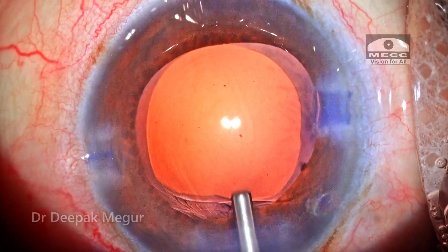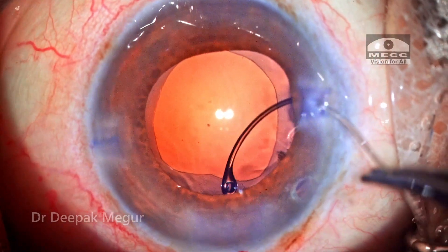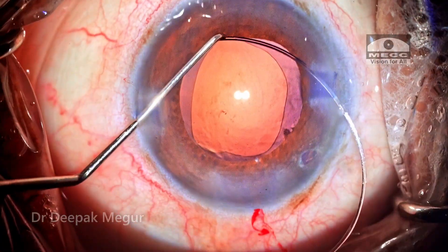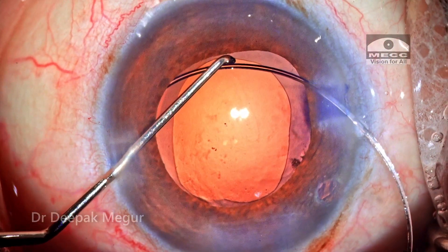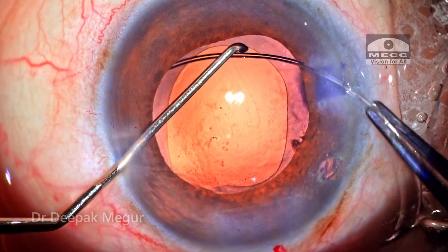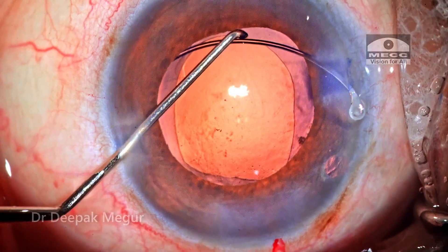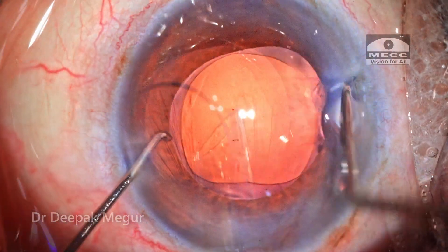Once the bag is clean, it is inflated with OVD and it's time to insert the capsule tension ring. This is the standard way in which I insert a CTR — it's a bimanual maneuver. The left-hand Sinskey hook is used to compress the ring as it is being threaded into the bag, ensuring that lesser stress is placed on the zonules during CTR insertion.